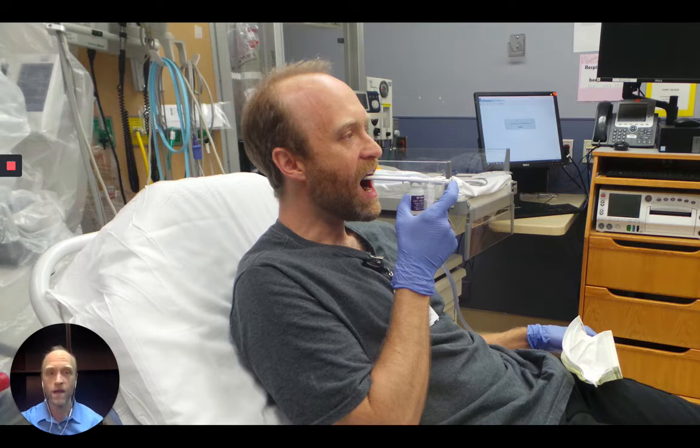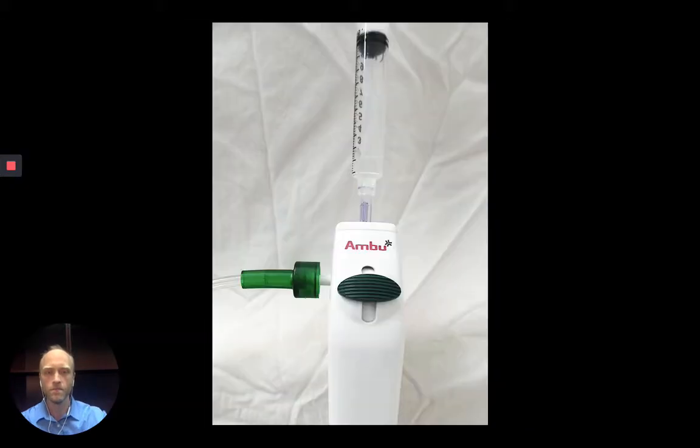Therefore, in your average patient, you still have quite a bit of room for additional lidocaine if needed for patient tolerance and still stay below 8 milligrams per kilogram. Many like to spray additional lidocaine through the working channel of the scope during the procedure. Keep in mind that it may not be necessary if you adequately anesthetize the entire airway prior to inserting your scope. It takes about 1 minute for your additional lidocaine to work, and you may cause side effects such as cough or even laryngospasm with the delivery of lidocaine through the scope.